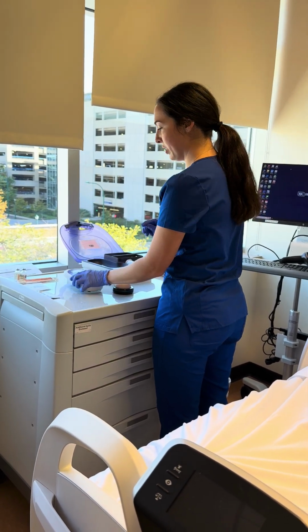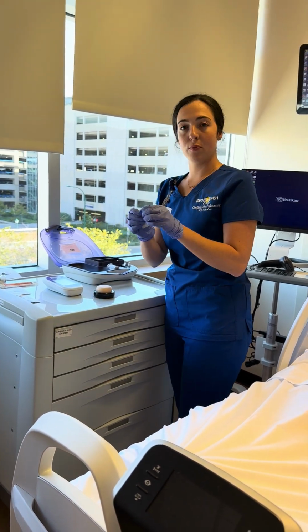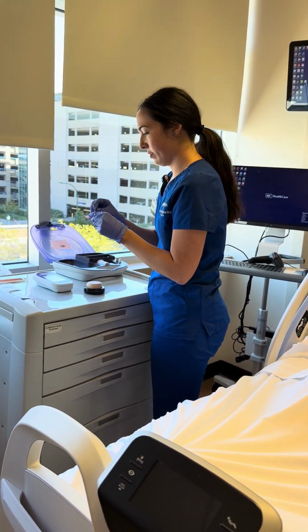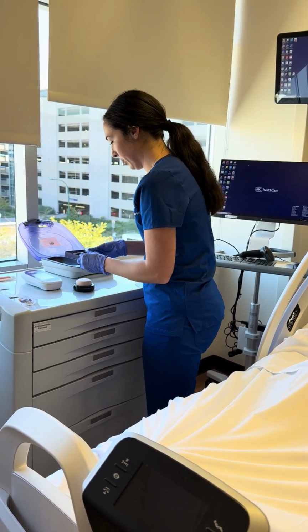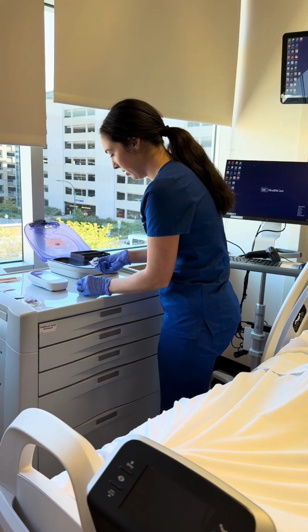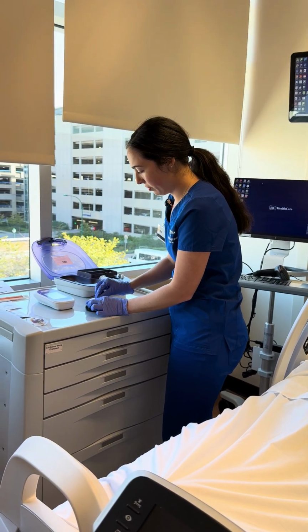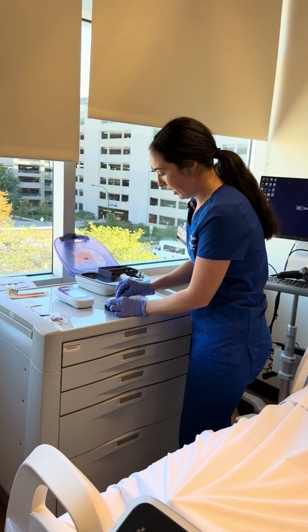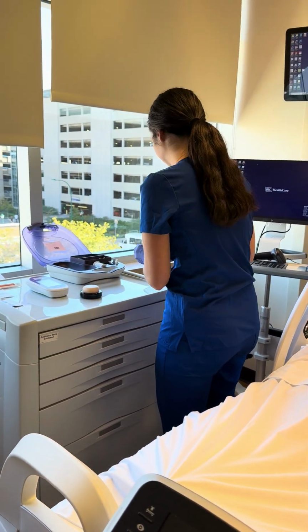Okay, so now I'm going to take an alcohol wipe and wipe down the area. I'm going to pinch a little bit here, make sure I can get good blood flow. Wipe down that area. Let that dry for just a moment.